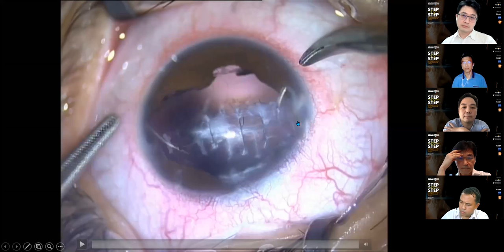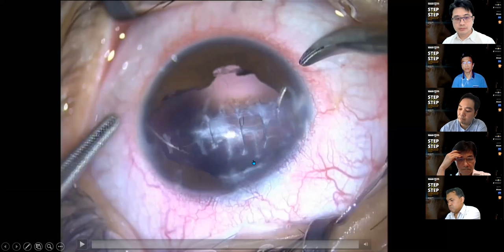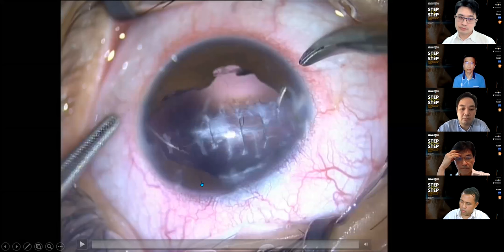together with the extensive loss of uveal tissue, we went in many times for this child. First, we had to go in and suture the cornea, and then went in again to remove the ruptured lens and anterior tract. And because he's young, he developed a cyclitic membrane. Then we went in again, removed it and did a proper vitrectomy. This is the eye by then. Looking at the posterior segment, it's still good. Optic nerve function is still good. Macula is normal. So I thought there would be a benefit if we implant the IOL, and I decided to implant an IOL.